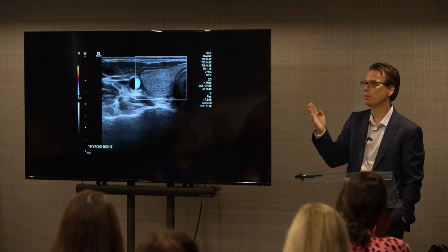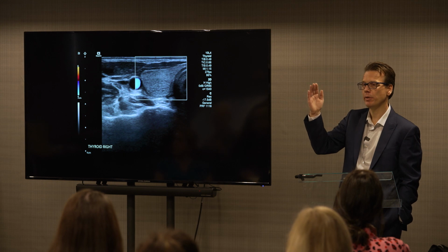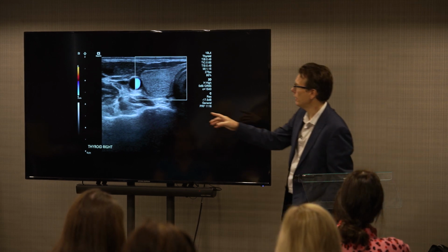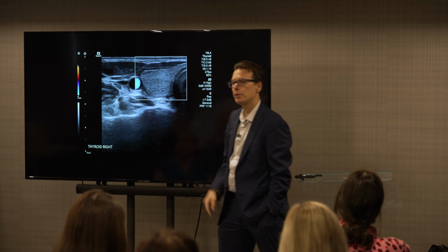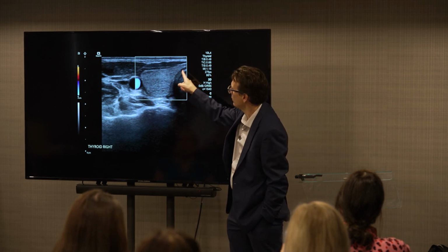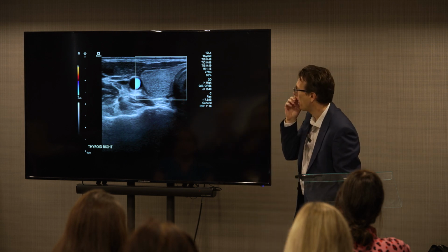It doesn't matter what your routine is, as long as you stick to it so you don't miss anything. So take an image from the superior pole, mid-thyroid and inferior pole. You can see here that, calibrated, this is what you should be seeing: the colour Doppler is within the walls of the common carotid. And again, look at the echo texture of the thyroid, how uniform it is. So that's what normal looks like.